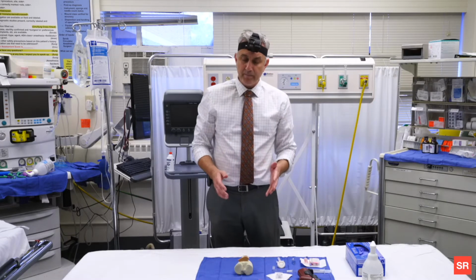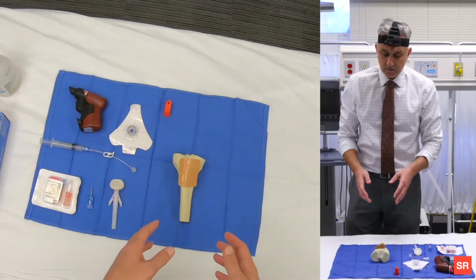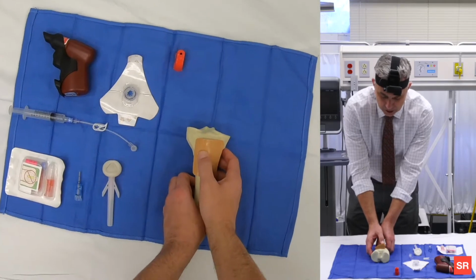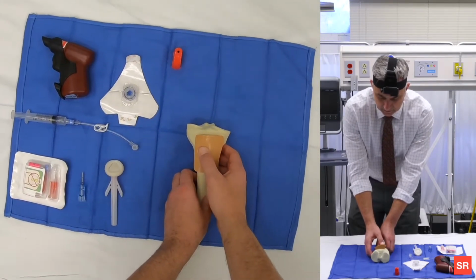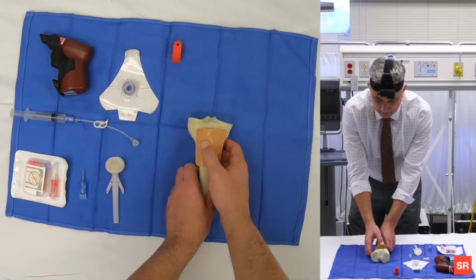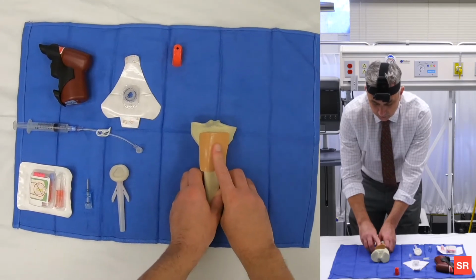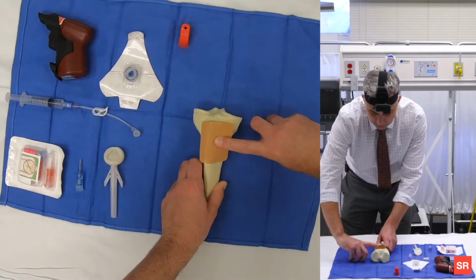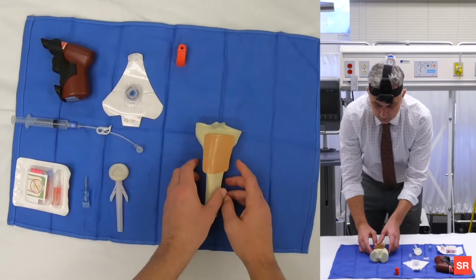I'm going to position the patient. The patient needs to have their legs extended. And what I'm going to want to find is the tibial tuberosity by palpation here. So I'm going to palpate down to the tibial tuberosity. Where I'm going to place this needle on a pediatric patient is 1 centimeter medial and 1 centimeter inferior to that tibial tuberosity.